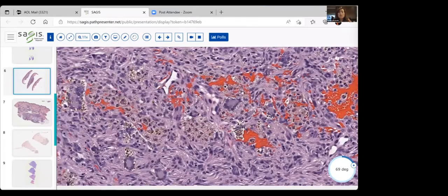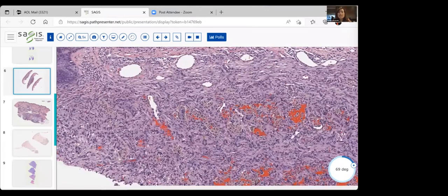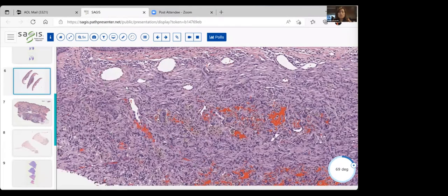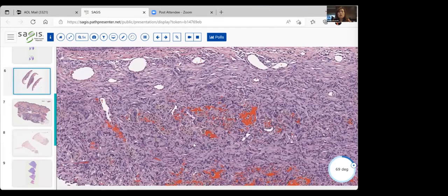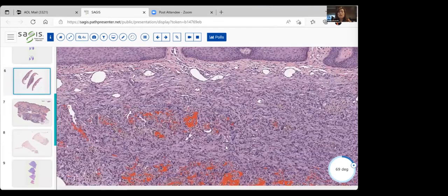And again, if I pull back in magnification, you can see that this dermatofibroma is characterized by many large vascular spaces, aneurysmal-like spaces. Sometimes they're much bigger than this. And then you get extravasated red blood cells, you get hemosiderin, or the iron from these red blood cells. And then as part of this type of dermatofibroma, you have macrophages or multinucleated histiocytes banding together to take that up.